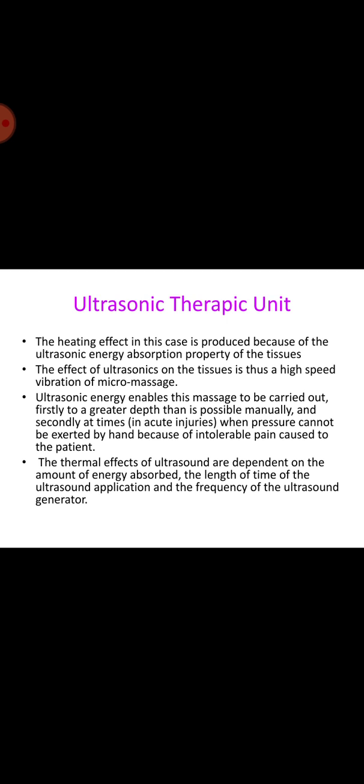The thermal effects of ultrasound are dependent on the amount of energy absorbed, the length of time of the ultrasound application, and the frequency of the ultrasound generator. The electrical power required in most of the applications is usually less than 3 watts per centimeter square of the transducer area that is in contact with the part of the body to be treated.